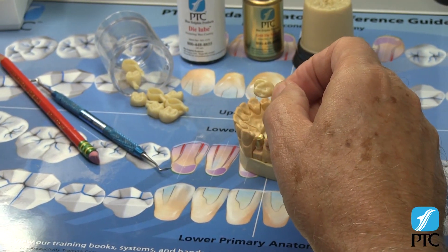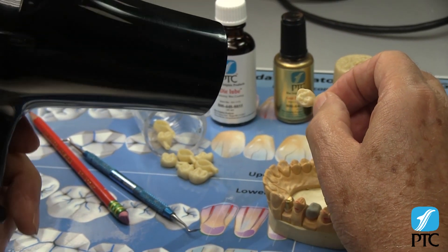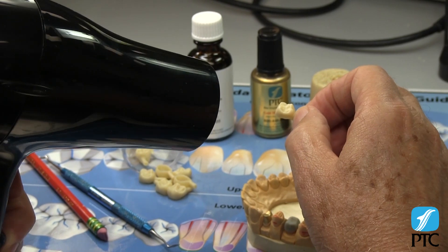Simply soften the wax with a hair dryer set on high heat until you see the wax start to look transparent. Be patient and give the wax time to soften completely.